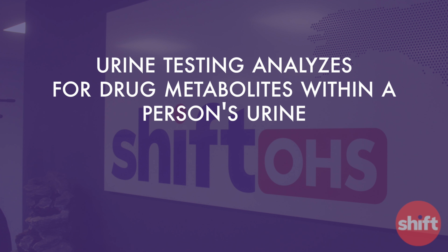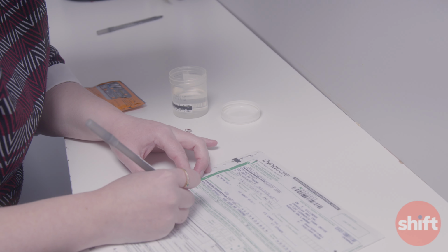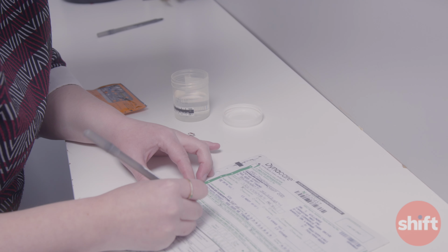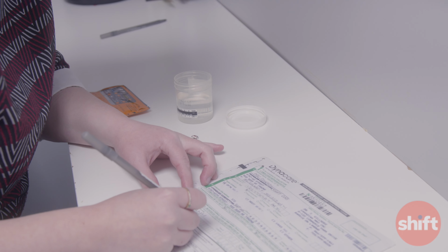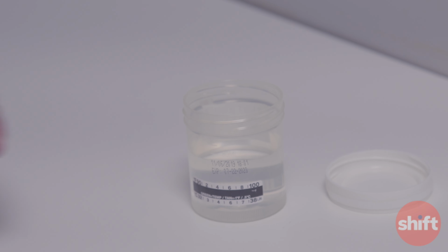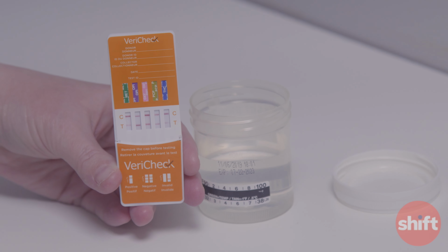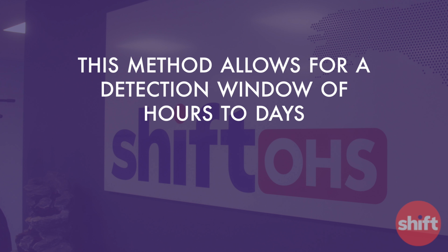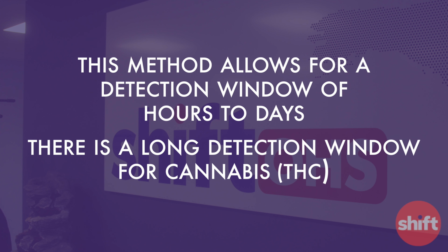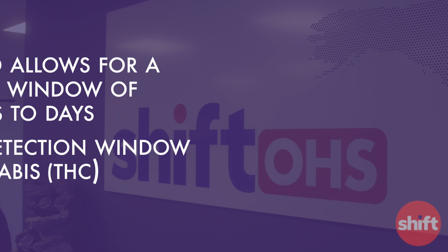Urine testing analyzes for drug metabolites within a person's urine. Urine testing is the most commonly used test within safety-sensitive workplaces due to its simplicity in administration, accuracy, and relative quickness of results. Urine testing can be done in an instant format, as in a POCT or drug screen, and as a lab-based test. This method allows for a detection window of hours to days, depending on the substance. However, there is a relatively long detection window for cannabis or THC. Though urine-based testing remains a good screening tool, it cannot be used to detect impairment.